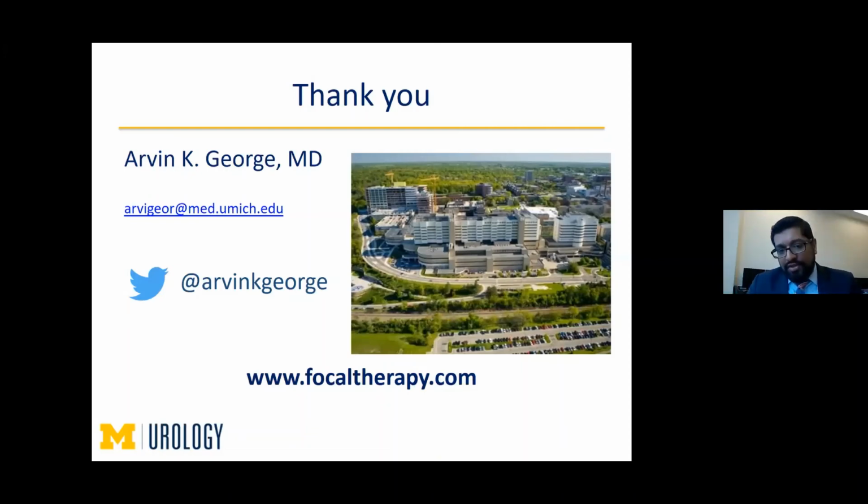Yeah, that's a great question. So with regards to cryotherapy, size of the prostate is not really a concern or consideration. With HIFU, it has to be somewhere between 35 and 40 grams. The reason is that beyond that, it's difficult for the HIFU beam to reach. And some sites can debulk it by doing a HoLEP, or if it's a peripheral zone lesion, doing a TURP to get it, if it's on the borderline, within the achievable size. But that's generally the size restrictions for HIFU.